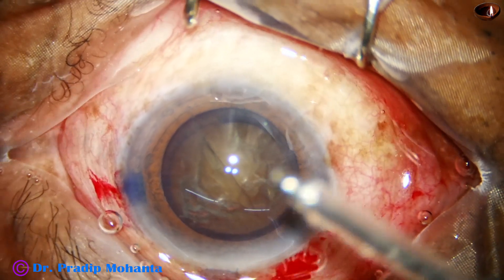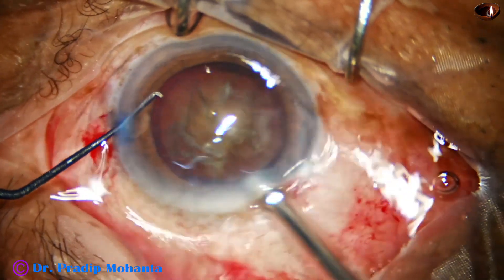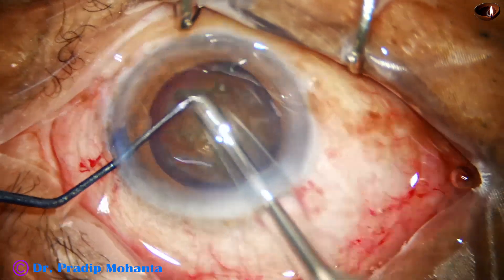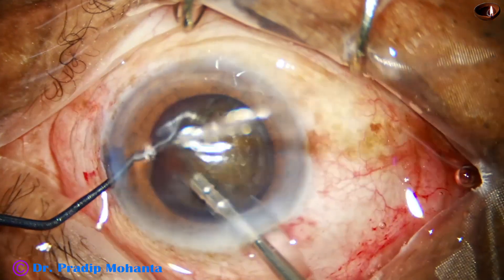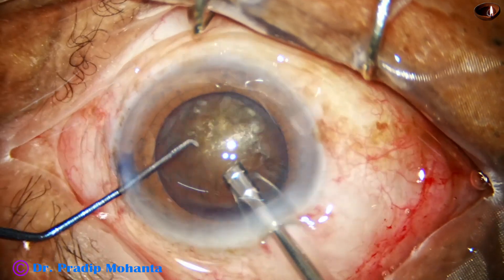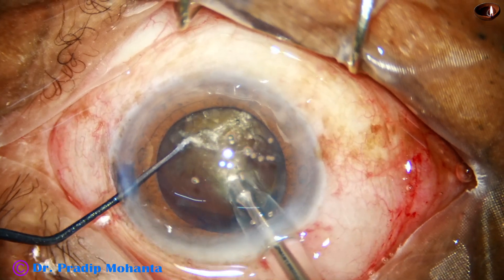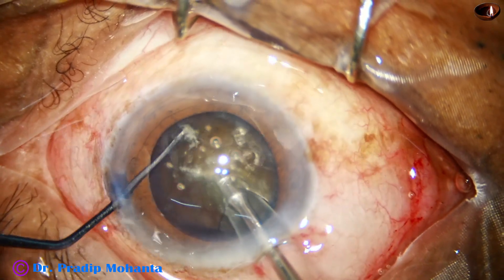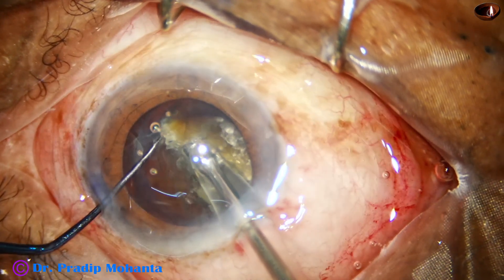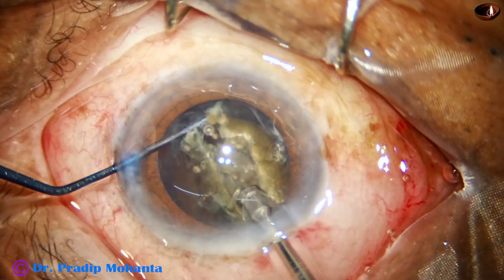In such cases — such hard cataracts — what I do is I bury the tube just in front of the rhexis and go through the substance of the nucleus towards the opposite equator. First the tube removes some superficial lens matter, and now going into the substance of the nucleus with full energy — about 80 percent ultrasonic energy — and as I reach near the opposite equator I use the chopper to get a good crack.